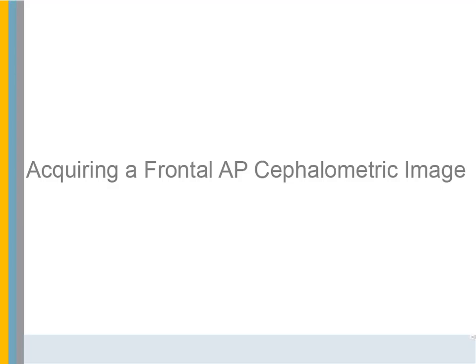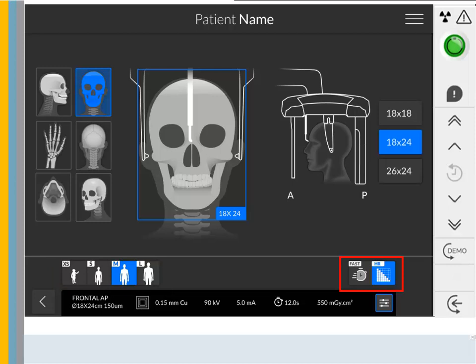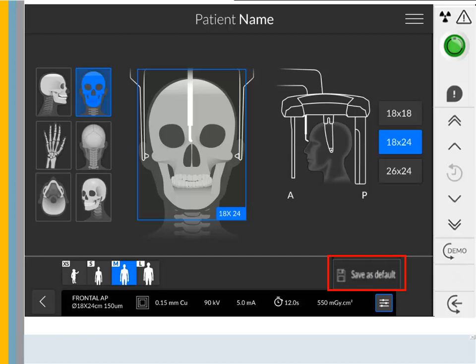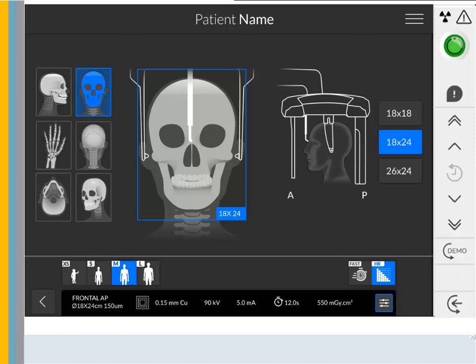Acquiring a Frontal AP Cephalometric Image — Positioning the Patient. On the touch screen control panel, select the frontal AP program icon and choose the field of view. Select the patient type and choose the imaging mode: fast or high resolution. If the default parameter setting is not adapted for the patient type, click the parameters icon and set the parameters. To save the parameter settings, click Save as Default. Manually rotate the head clamps by the number of clicks and in the direction displayed on the position indicator. Note: the position indicator does not display if the head clamps are positioned correctly. When the head clamps are set correctly, the icon turns green indicating the CEF unit is ready to acquire images.